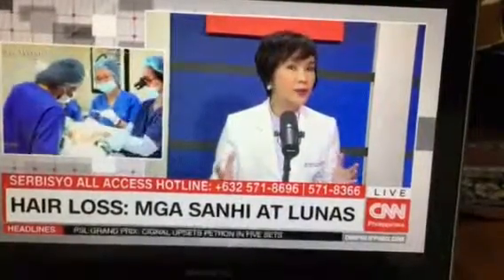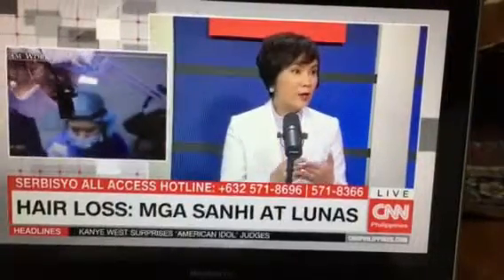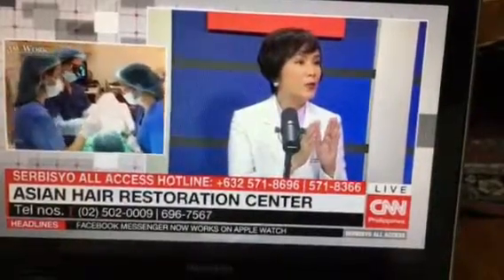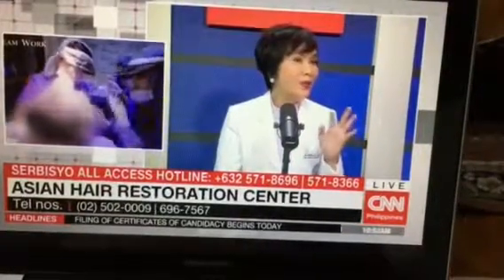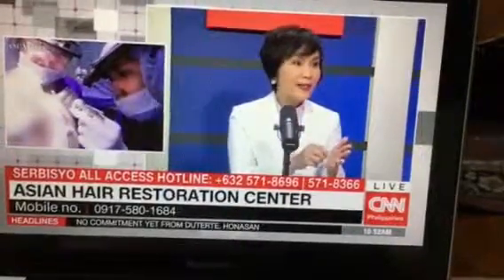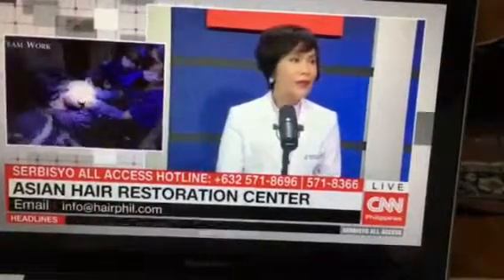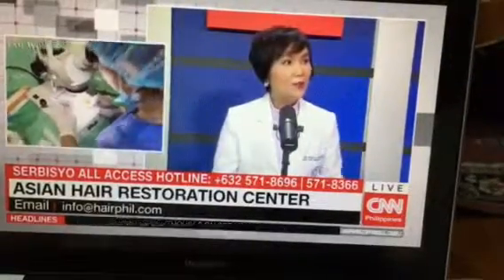We call that the surgical team, which the physician will train so that they take care of the follicles, yung grafts. Yung grafts na yon, they'll take care of it na hindi matutuyo, no, so that it will remain viable, fresh, so that when transplanted, it's very healthy, and when it's transplanted very healthy, the hair will grow. Mahirap yung hair transplantation, and the robot cannot do everything. It's just one portion.